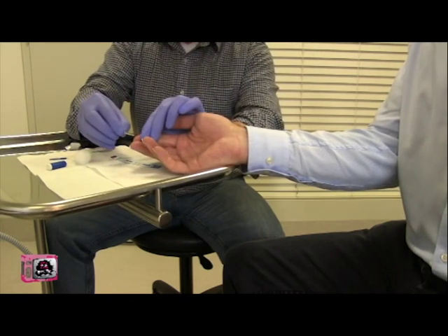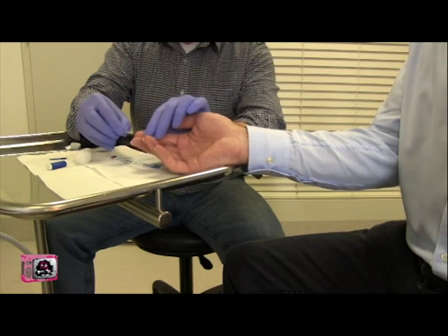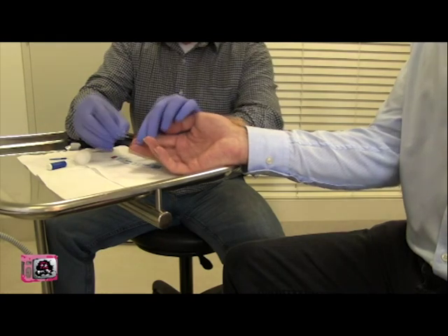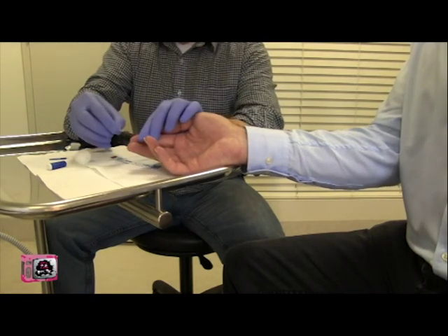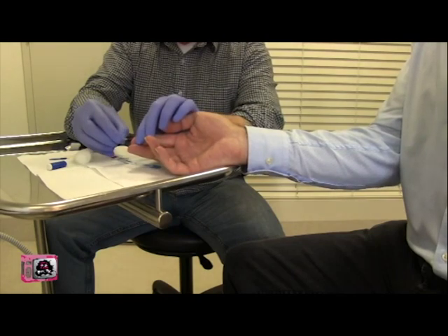It's a little bit more than a drop, it does take a little bit extra blood to do the actual test but it is a little bit more than say if you were doing a glucose test for diabetes.